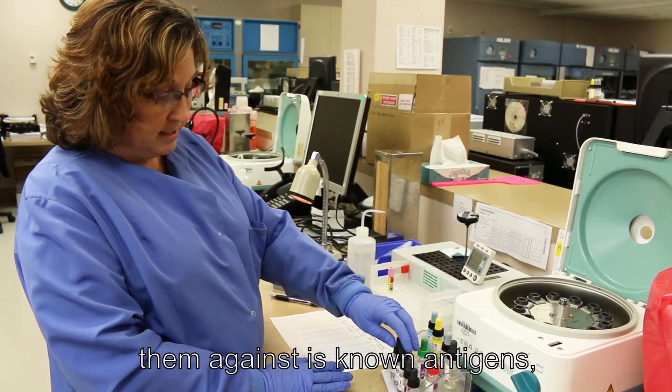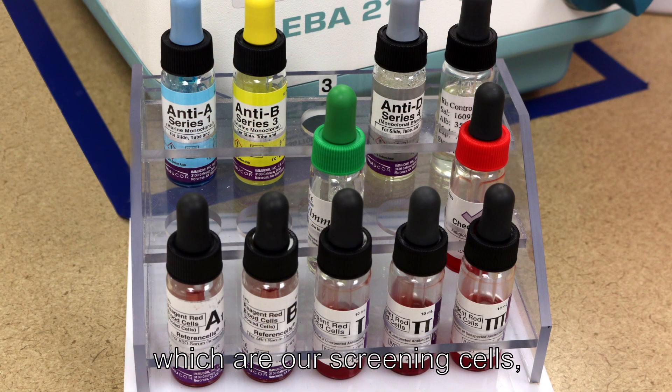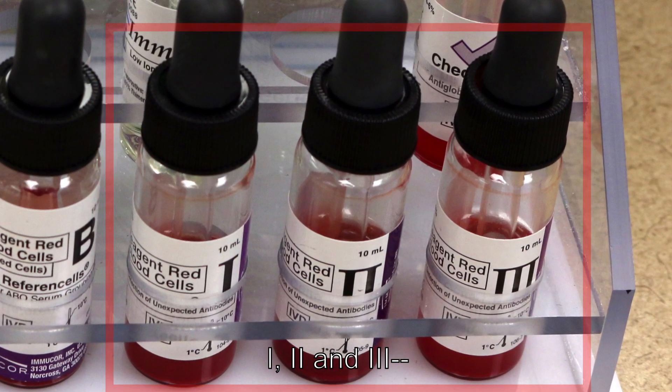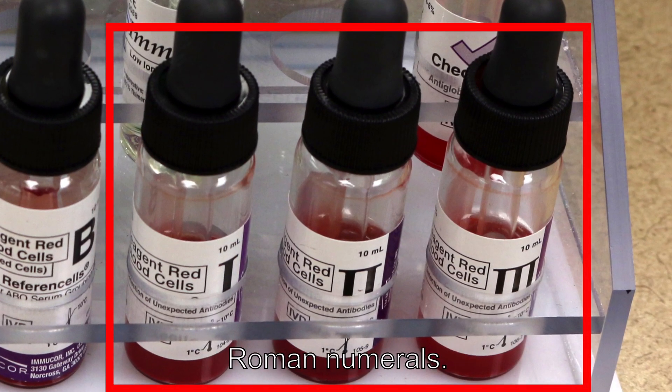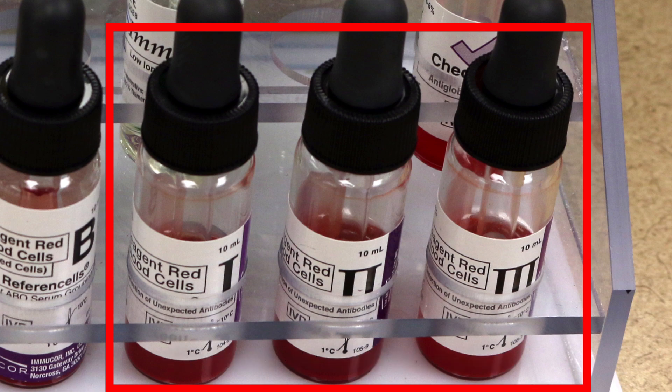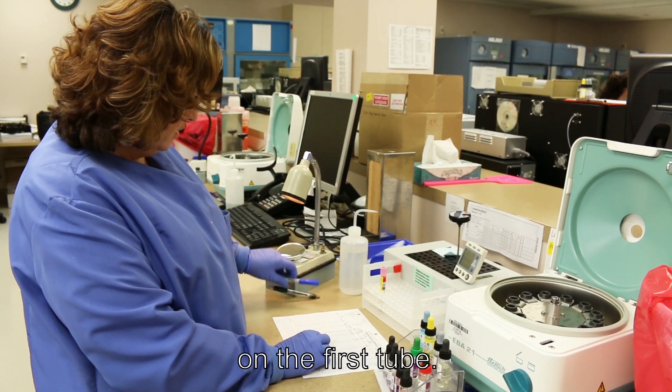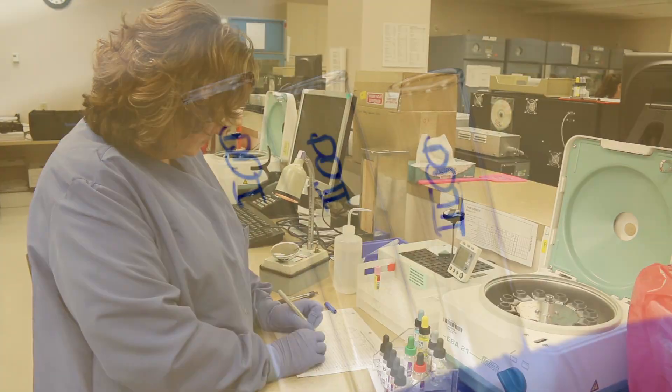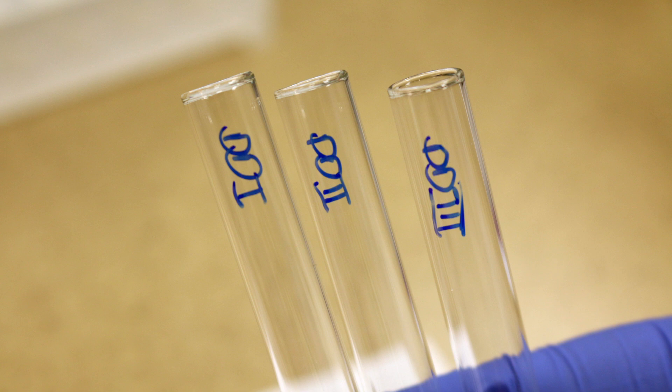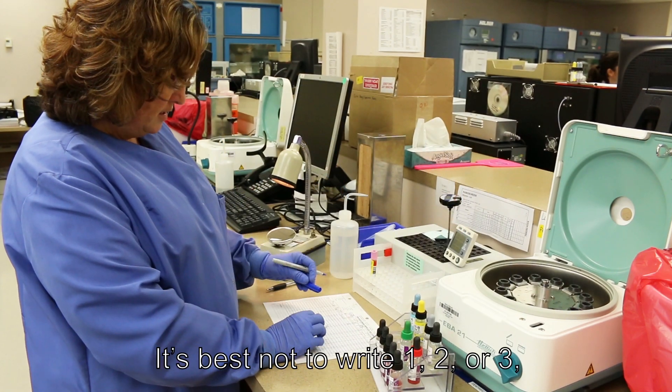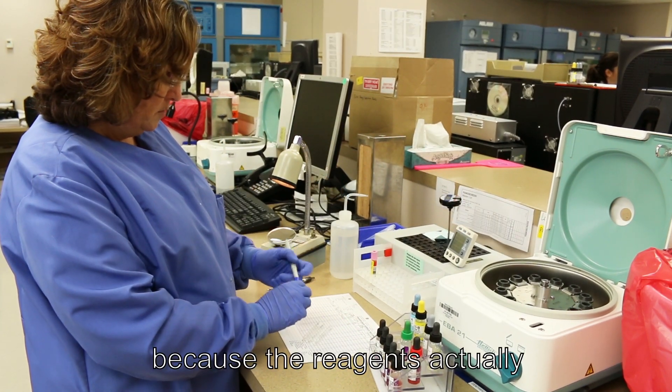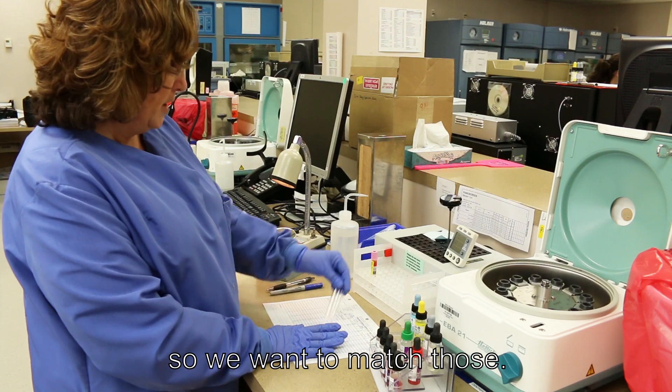So what we're going to test them against is known antigens, which are our screening cells, also called surges screens, 1, 2, and 3. Those are labeled with Roman numerals. So when we label our tubes, we're going to go back, use the patient's initials, Roman numeral 1 on the first tube, patient initials Roman numeral 2, and on the third tube we're going to do Roman numeral 3. It's best not to write 1, 2, or 3, because the reagents actually have the Roman numerals, so we want to match those.